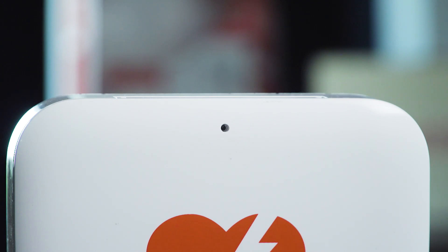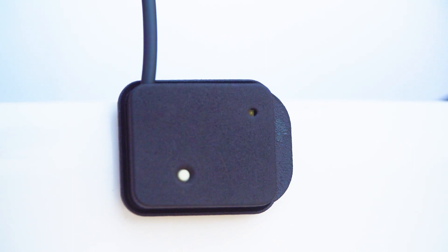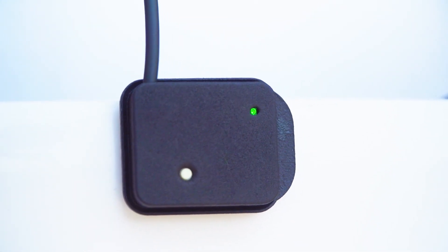If the AED has a blinking light for a ready symbol, the sensor will flash green while it is learning the AED's ready symbol. This may take one to two minutes.